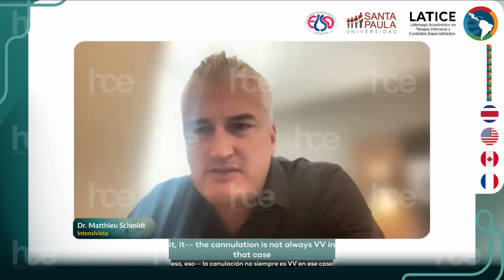Do you have experience cannulating patients with oncological disease, not necessarily primarily in the lung, as a temporary measure while they receive chemotherapy or other strategies? Yes, the cannulation is not always VV in that case, in my experience.